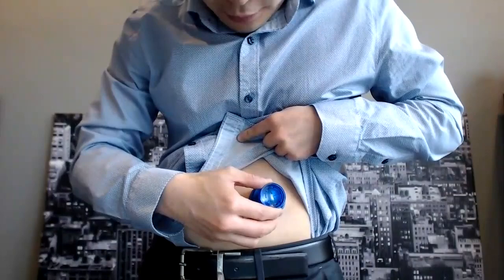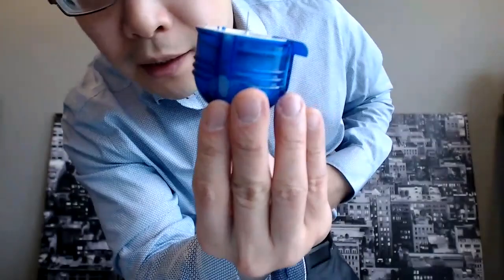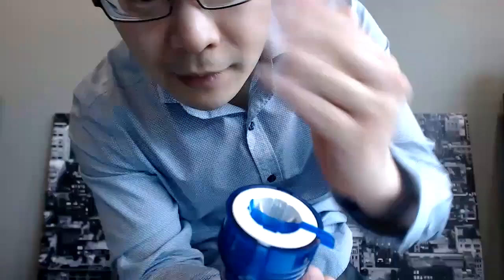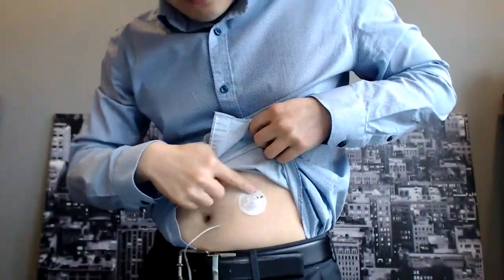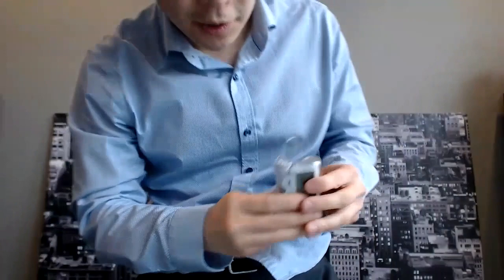pull out. There's the needle. There we go. Can you see that? There's the needle that gets pulled out. This I fold, making sure I don't poke myself. And as you can see, that insulin infusion is there. Okay. And now I can use this machine.